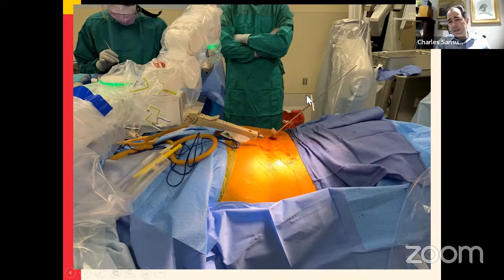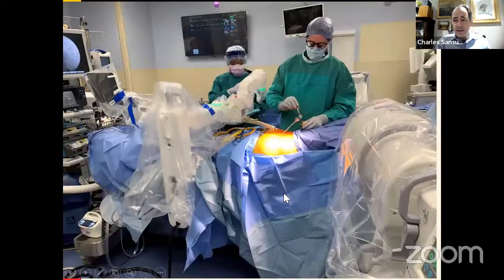This T-handled instrument is actually a reamer, and that reamer was used to create a decorticated path within the SI joint. Depicted here is the actual insertion of the bone funnel into the SI joint.